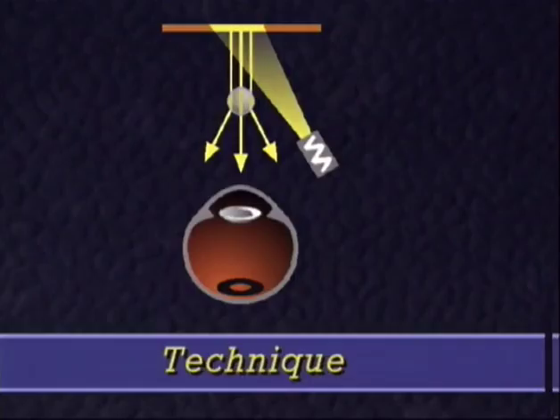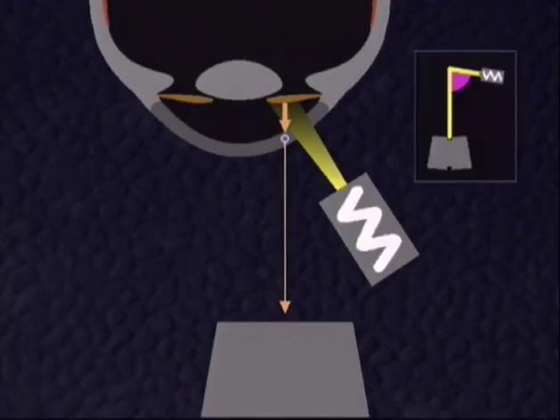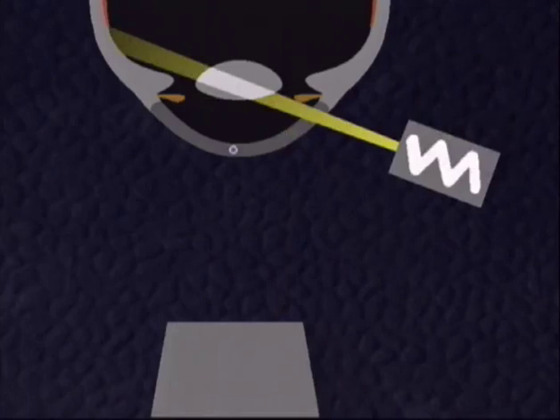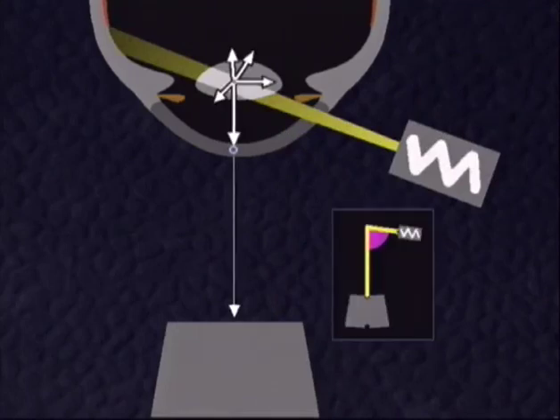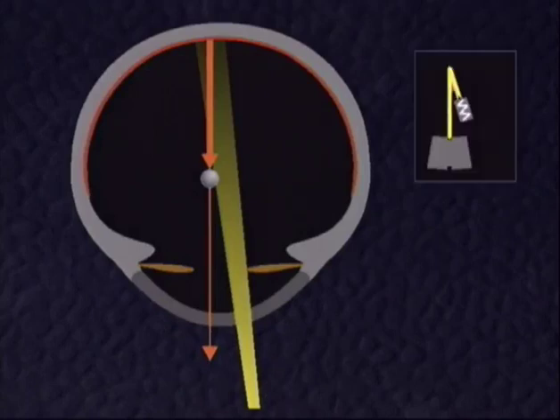How is the backlight produced in clinical conditions? The light source is the indirect light reflected from non-transparent tissue behind the refracting target. The illumination angles can be widely varied for retroillumination from the iris. For retroillumination from the lens, the illumination angle is chosen wide in order to obtain intense scattered light. For retroillumination from the fundus, the angle must be narrow because it is limited by the size of the pupil.